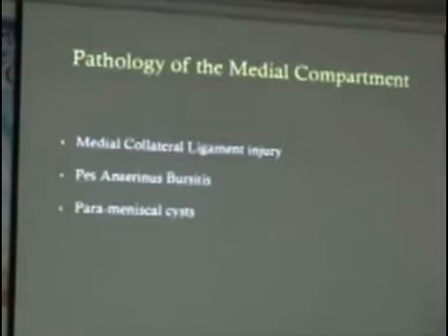So looking at the pathology within the medial compartment, we've got medial collateral ligament injury, we can see bursitis within the pes anserine, and we're able to see parameniscal cysts.